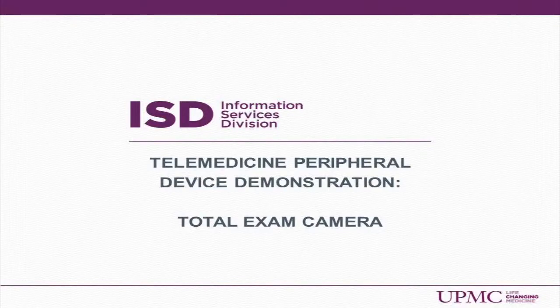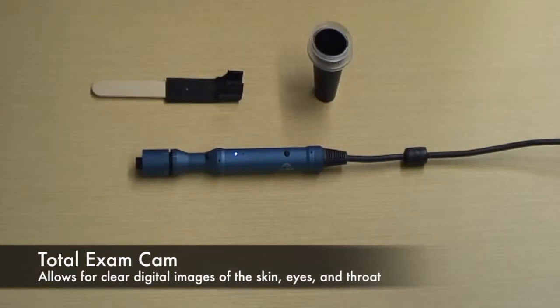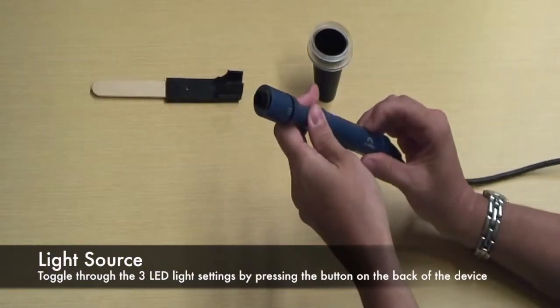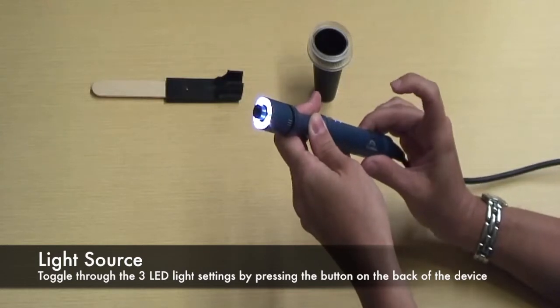Telemedicine Peripheral Device Demonstration: Total Examination Camera. The Total Exam Cam is a handheld device used to view the skin, eyes, and throat of the patient. The camera has three different LED light intensities controlled by the rear button.